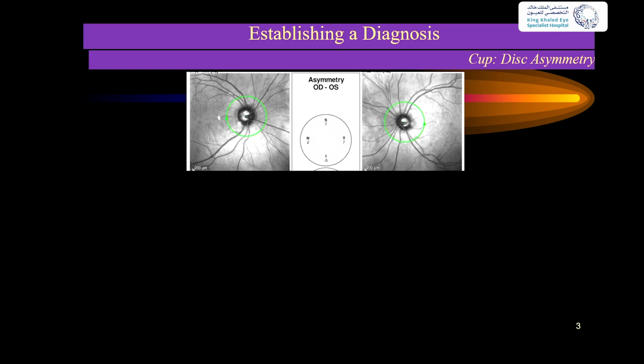Now, as I said, glaucoma is a diagnosis based on asymmetry. We always look for cup to disc asymmetry when we are diagnosing glaucoma. But for the first time we have the ability to see both optic nerves together in one image. I teach my fellows that the nose is the biggest impediment to diagnosis of glaucoma. Why?